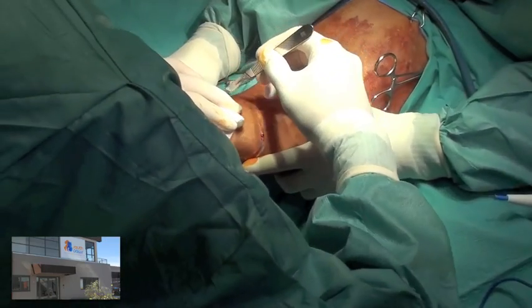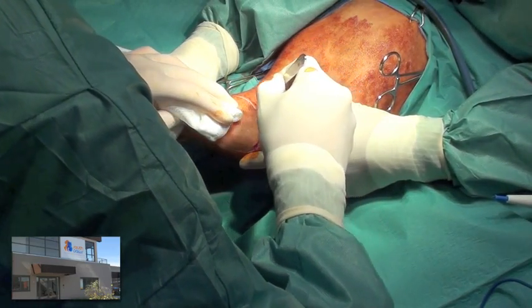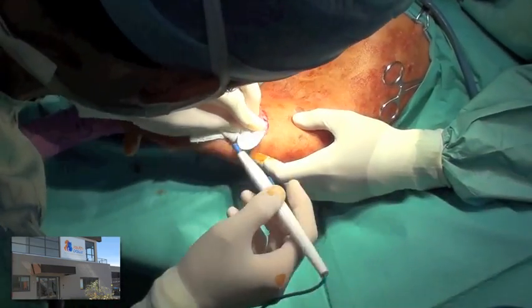An incision is made along the proposed line going all the way through the skin, the subcutaneous tissues, and down through the muscle fascia, which is overlying the cranial tibial muscle.